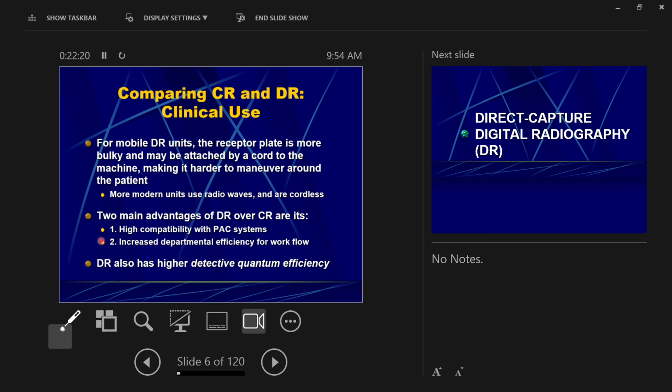If your processor is very close, or if you only have a couple of plates, you can be even more limited. But anyways, I had to do all my positions, take all my x-rays, and then go process them. That's how film and CR work. You basically took all of your images, and then you went and processed it, okay? And by the time you get done, you may have to repeat a couple of them because of exposure issues, because of positioning issues, okay?